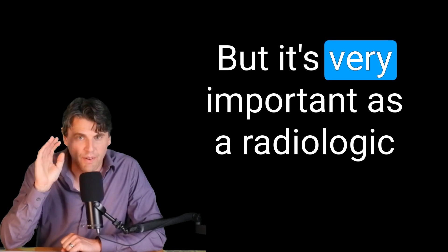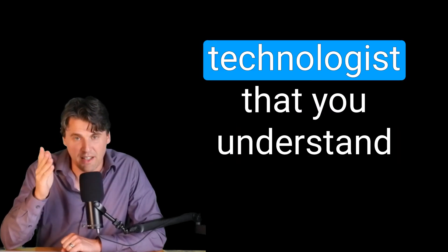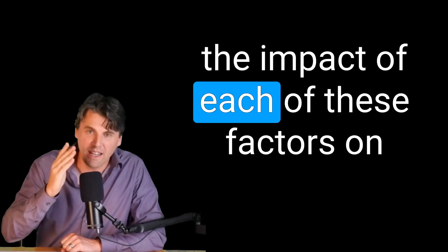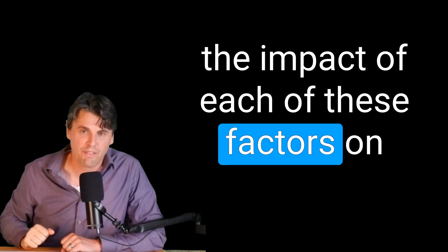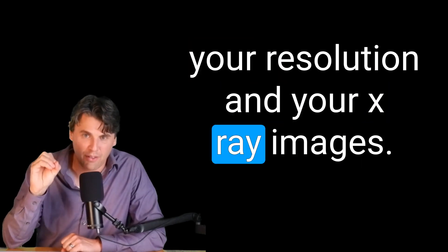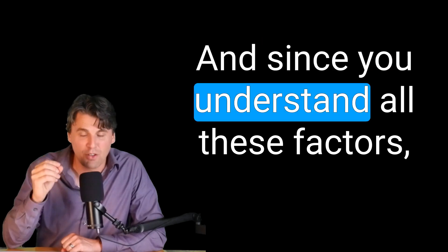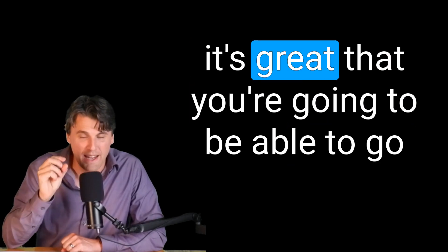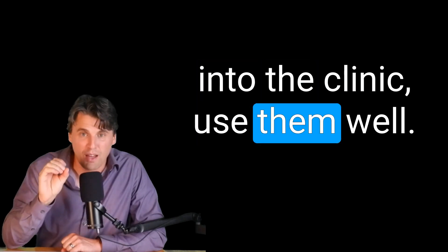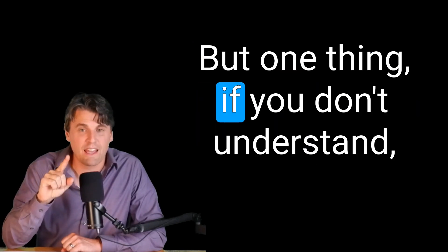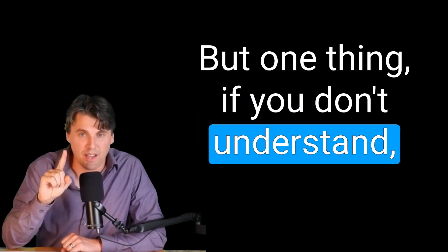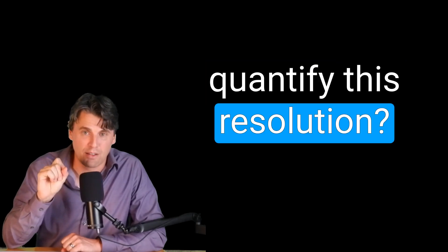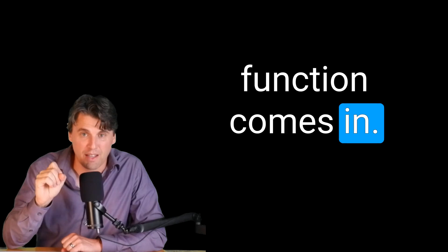But it's very important as a radiologic technologist, that you understand the impact of each of these factors on your resolution in your x-ray images. And since you understand all these factors, it's great that you're going to be able to go into the clinic and use them well. But one thing if you don't understand is how are you going to quantify this resolution. That's where the modulation transfer function comes in. Make sure and see our video next on the modulation transfer function and how we can actually measure the space resolution in our images. Coming up next.